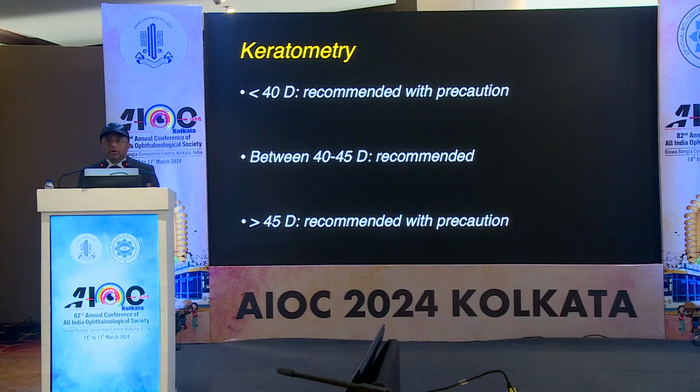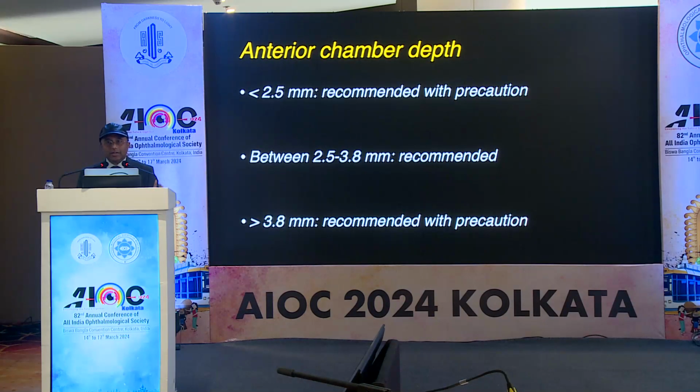As for the keratometry and astigmatism correction, as we have just discussed about monofocals or torics as a whole, the higher the astigmatism correction we aim for, the more difficult it is if there is a small degree of rotation. So we need to be careful that in multifocals, as the topic suggests, optimum satisfaction would be brought about if we choose not a very high astigmatism correction, but a moderate correction. And of course, the AC depth matters because the add power would also change.